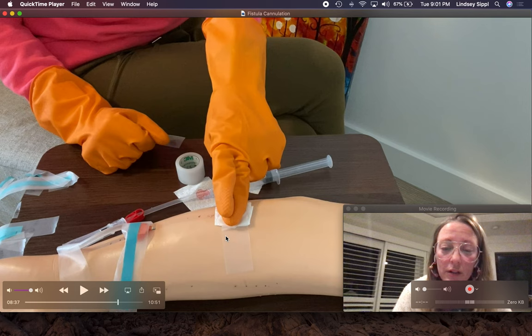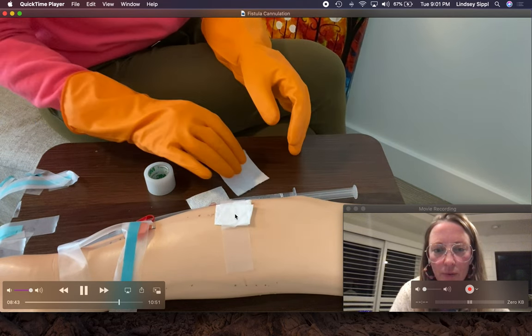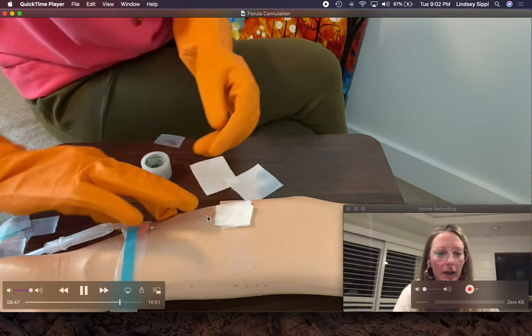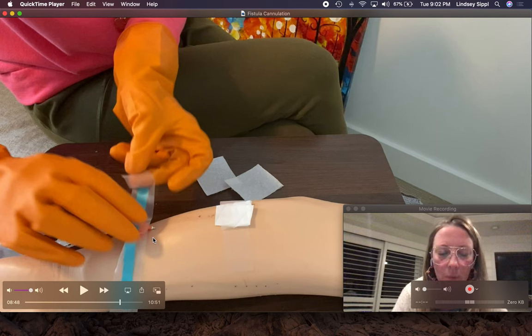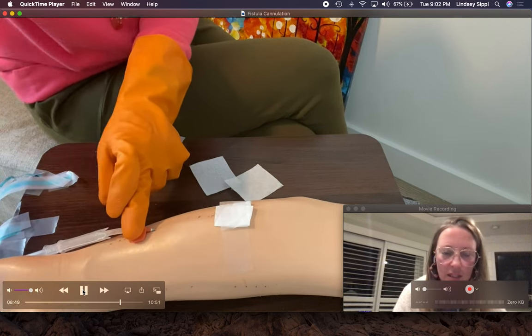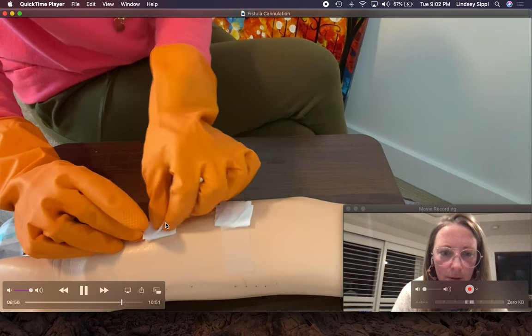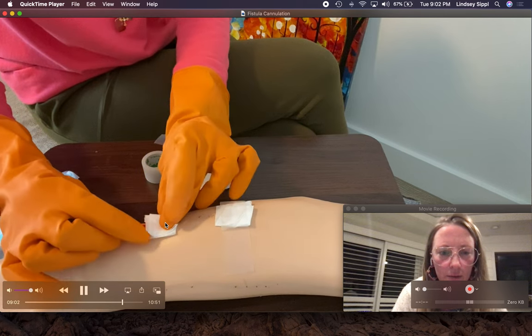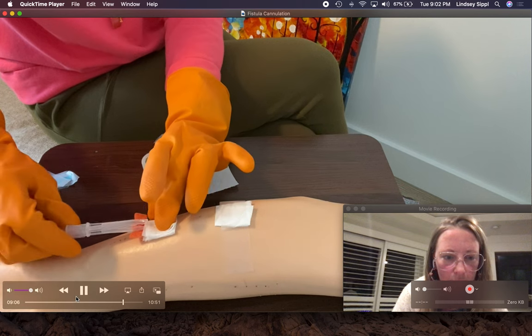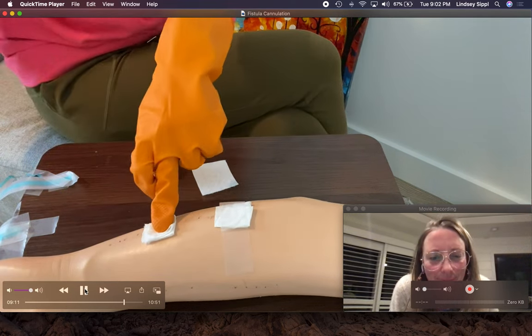Some patients can't hold their fistula site. Our facility allows clamps after the fistula is six months old — never clamp a graft. Encourage patients to hold the site themselves. In an acute setting where you're alone and the patient can't hold their site on a graft, you can take one needle out, hold pressure until it's done bleeding, then move to the next needle. When removing the arterial needle, make sure the wings are flat — don't pull out the needle while the wings are folded. I'm going to pick a clean corner, place it on top of the needle, get the safety ready, and pull it out.